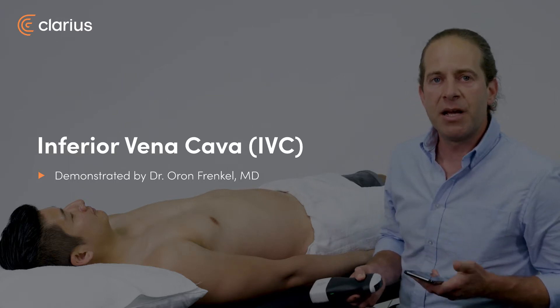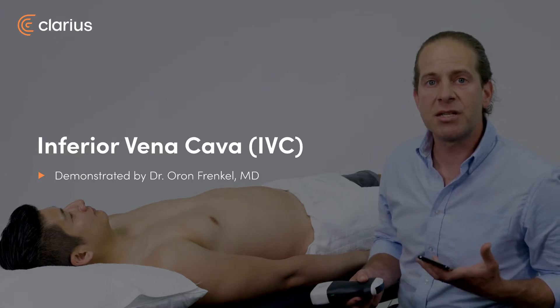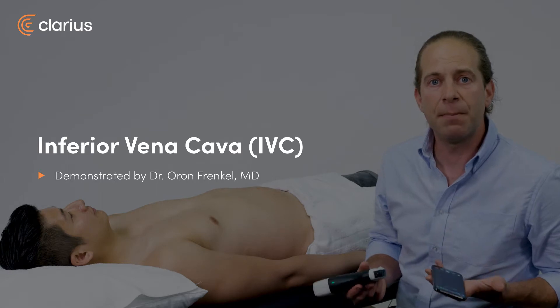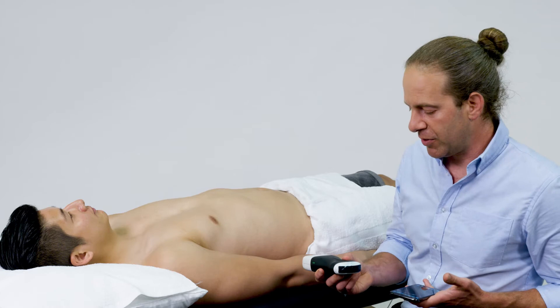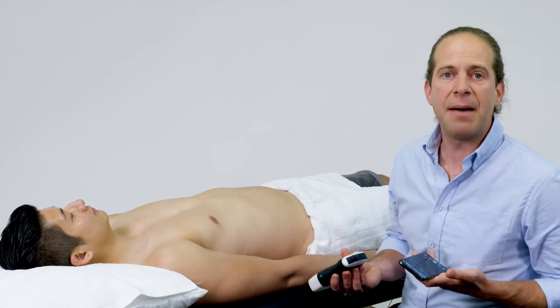In a patient with hypotension or dyspnea, a quick assessment of the patient's central venous pressure can be obtained at the bedside by scanning the IVC. I can perform this scan with the curvilinear scanner on the abdomen preset.